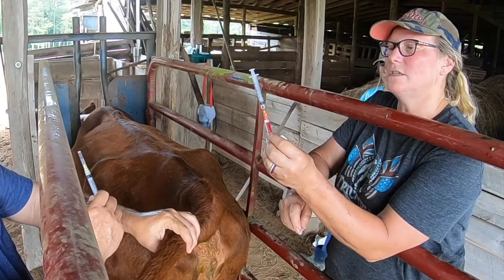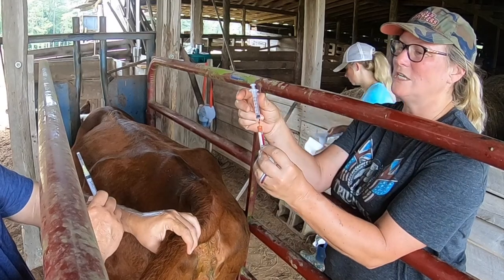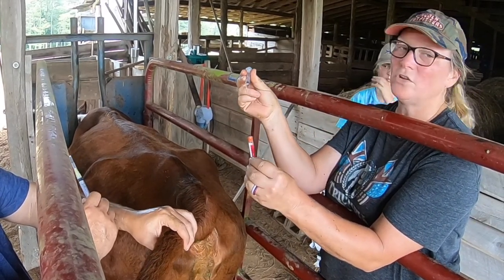The reason I go ahead and do this is because if you don't, it'll clot in the syringe and it makes a huge mess. Learned that the hard way.